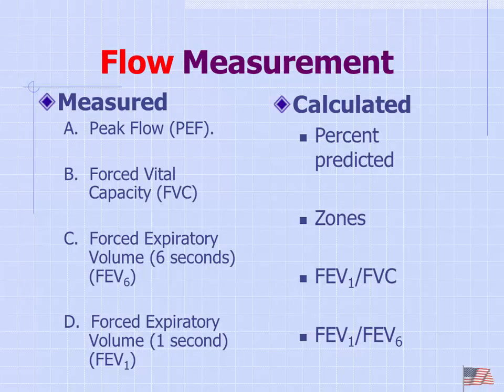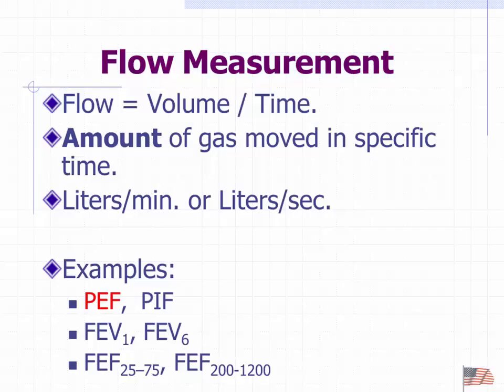Second thing we want to do is talk about flow. We'll talk about using peak flows, and we'll talk a little bit about the zones. We'll review some stuff that Lori talked about with the forced vital capacity. Since I know that was so much fun way back in 1050, why not go back and do it again? I'm lying, of course I am.